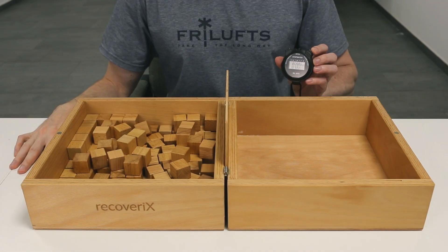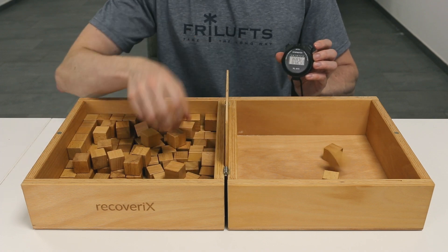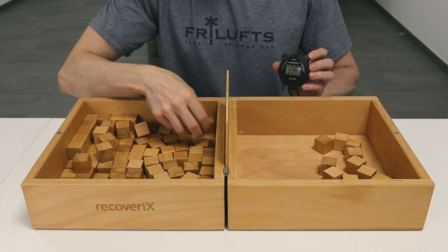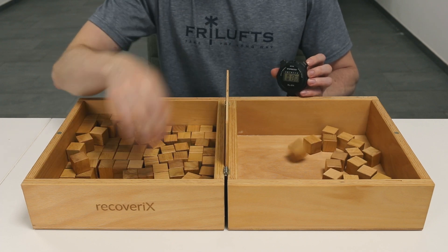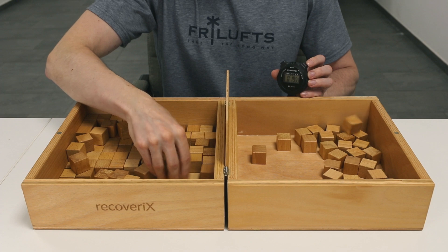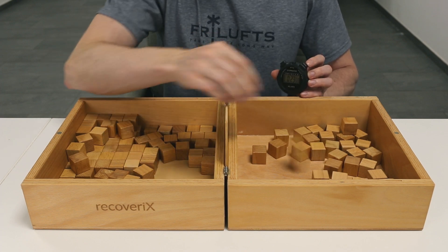Each block's positioning should ensure some degree of separation, helping patients access individual blocks easily without having to maneuver around tightly packed stacks. The patient is instructed to move as many blocks as possible, one at a time, from one compartment to the other for a period of 60 seconds. If performing the test for both hands, start with the less affected side first. If there is no clearly affected side, start with the dominant side first.